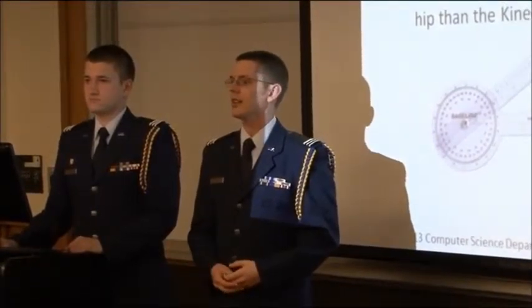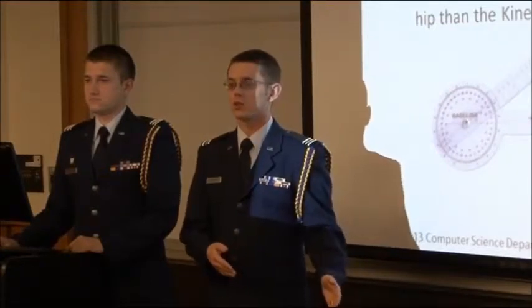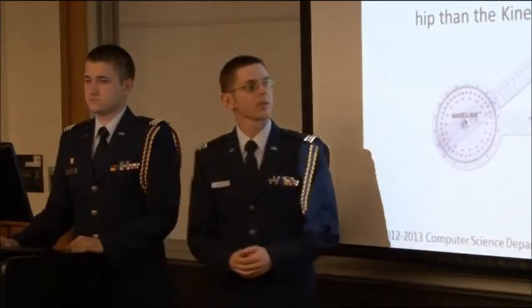This made us realize that there was a difference between the joint that the Kinect was tracking and the joints that we wanted to track for this test. And Scott will elaborate on this.